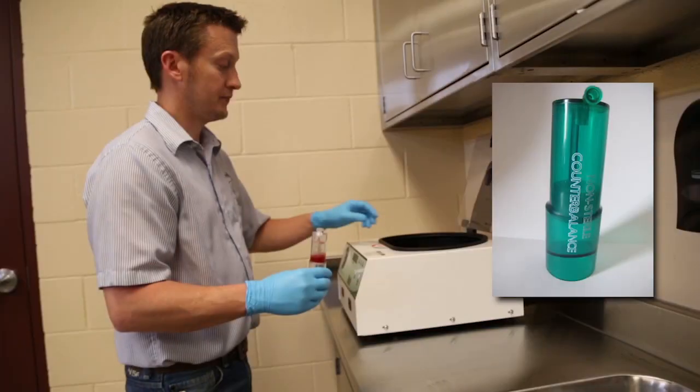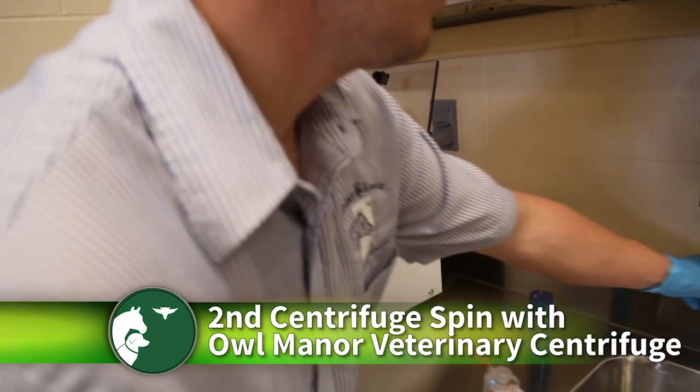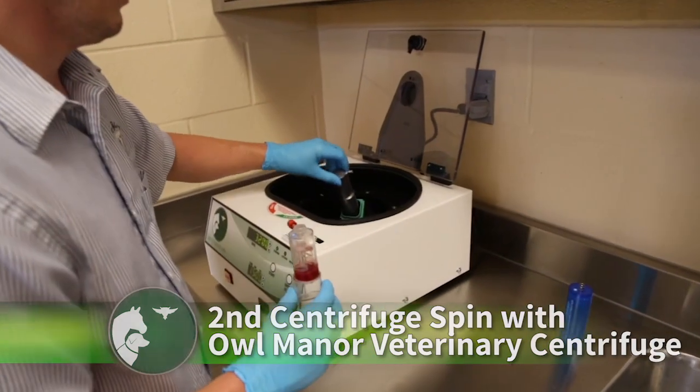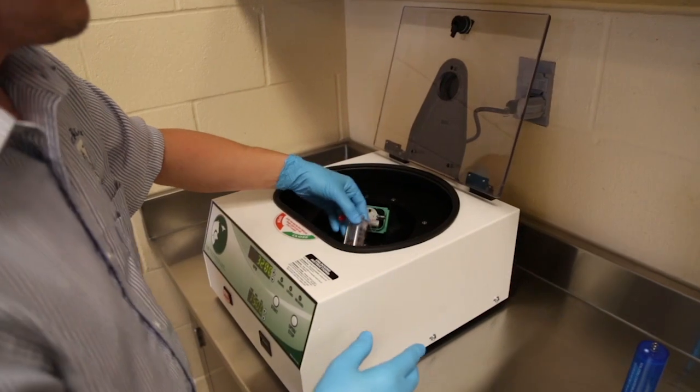Load the concentrator device in the centrifuge, ensuring appropriate balance. The ProStride counterbalance is weighted to appropriately balance the concentrator device. You will need to remove the counterbalance used in the first spin. Again, make sure to load the device with the ports placed horizontal, facing left and right, and not vertical.